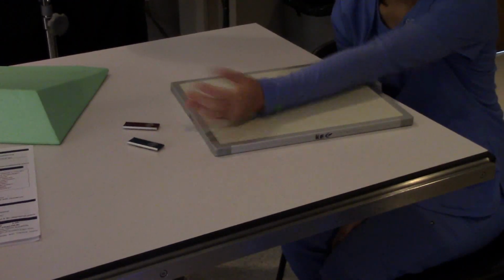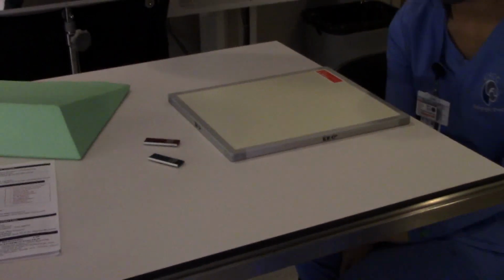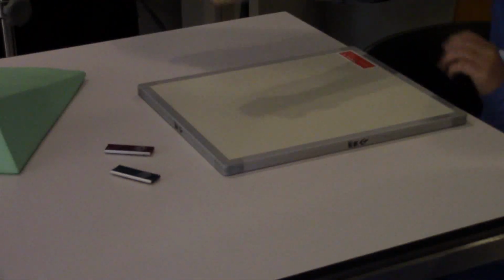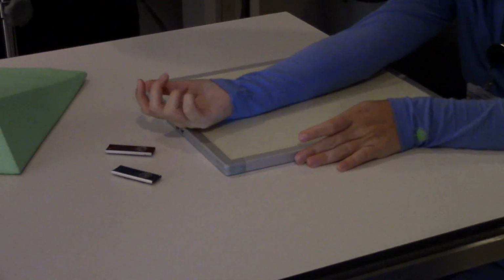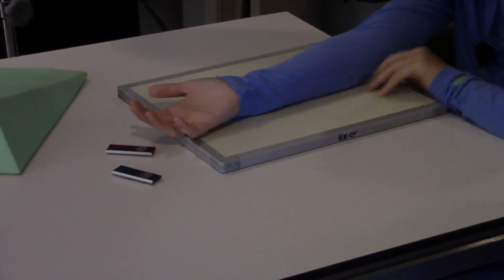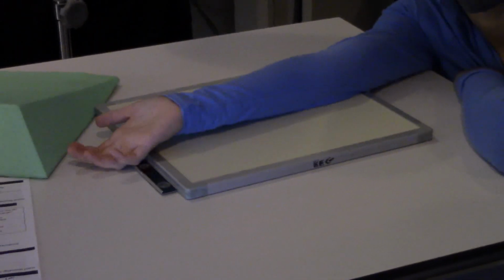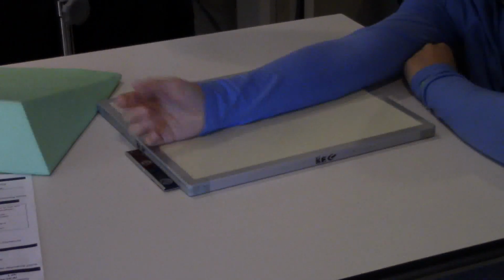And it just so happens that Ms. Abby needs exactly, her forearm is hurting for certain. So how are we going to position for a forearm x-ray? Well, this is a self-positioning patient.